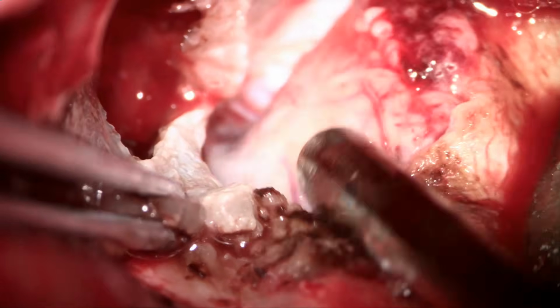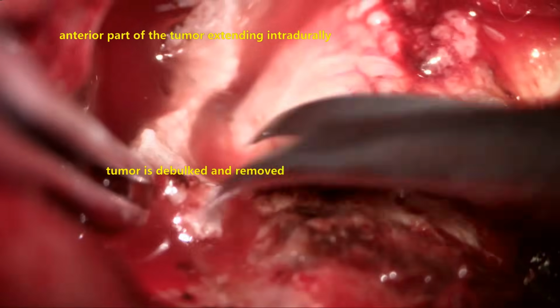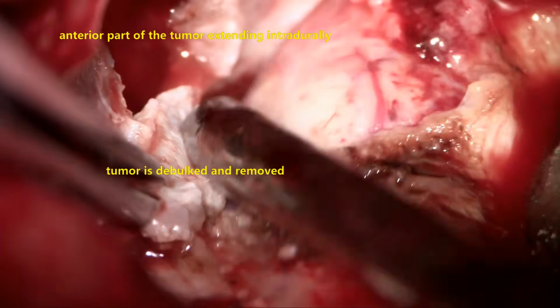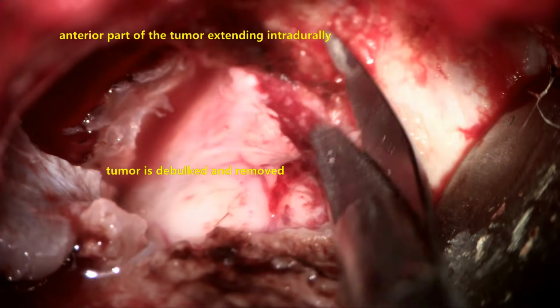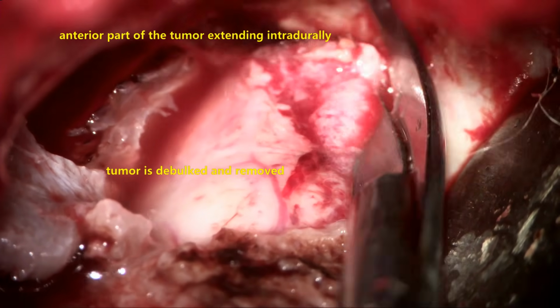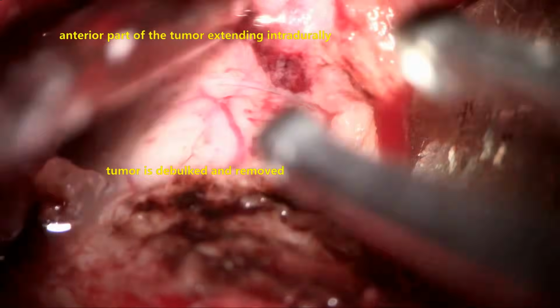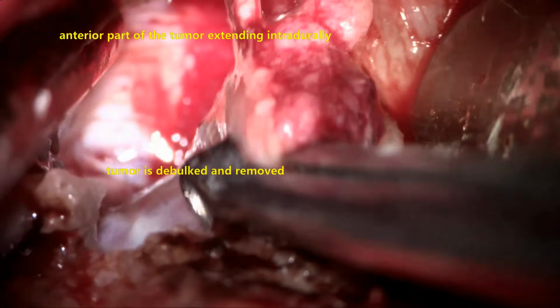The dura mater is wide open along with the capsule, exposing the anterior-most part of the tumor, and the tumor capsule is opened and internal debulking of the tumor is done.